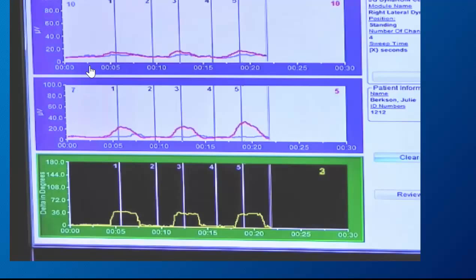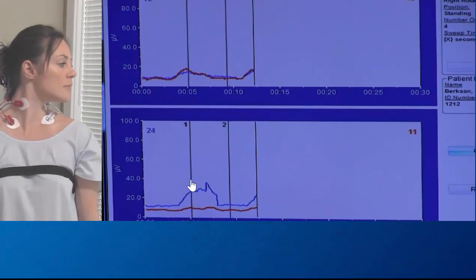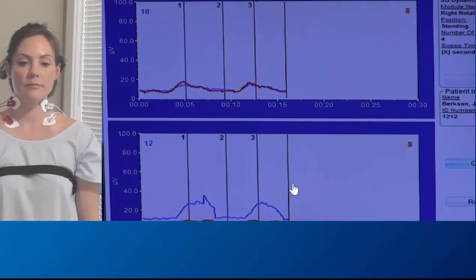When you perform a lateral flexion, one side should fire and not the other. In a rotation, you can see as you rotate, muscles fire. We're looking at the CPs up here and the SCMs down here.